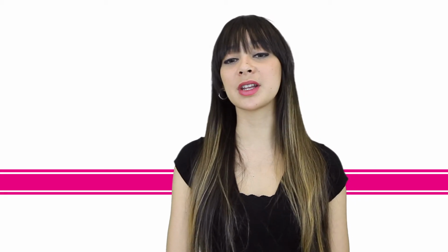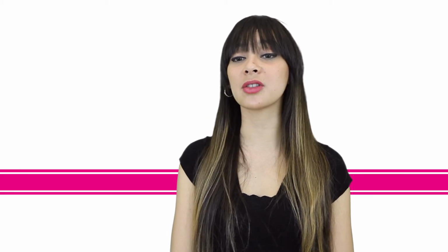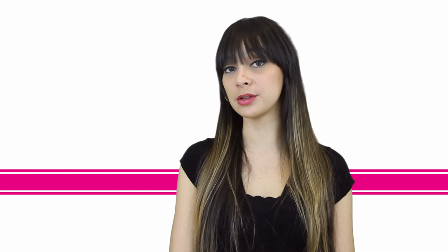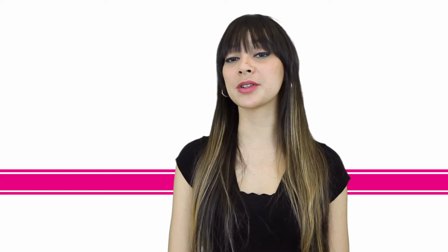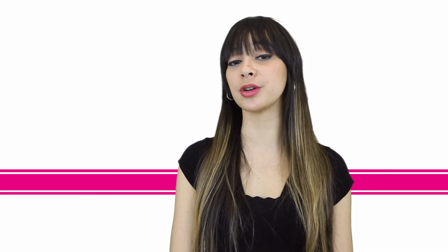A plastic string that is tied to the end of it will hang down through the cervix into the vagina. This string is used to check that your IUD is in place and is also used for the removal. You may want to see your doctor about 4 to 6 weeks after it is inserted to make sure it is still in place. You may experience mild to moderate cramping during and following the procedure, but it typically does not last long.